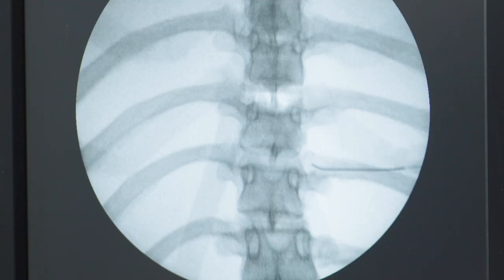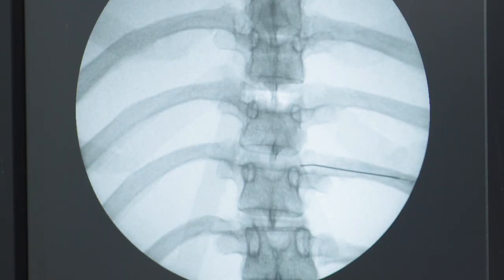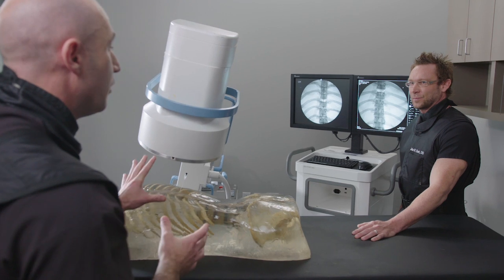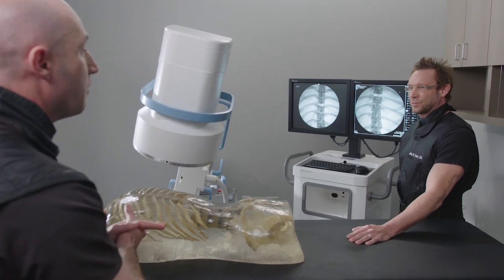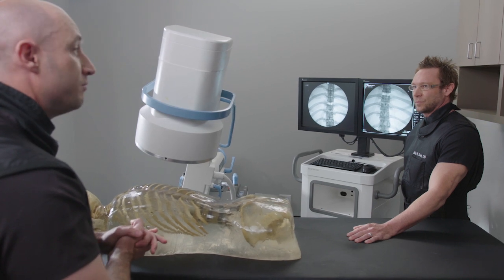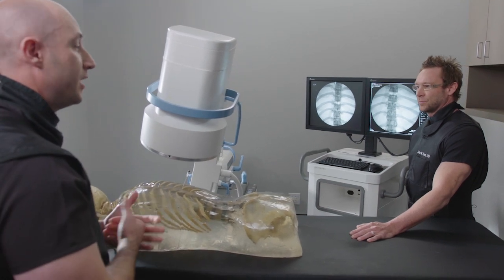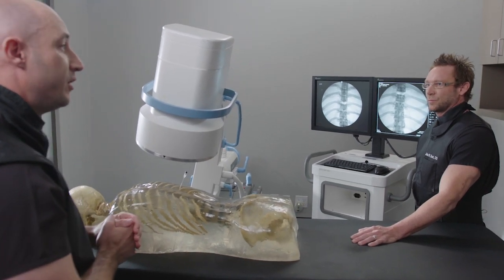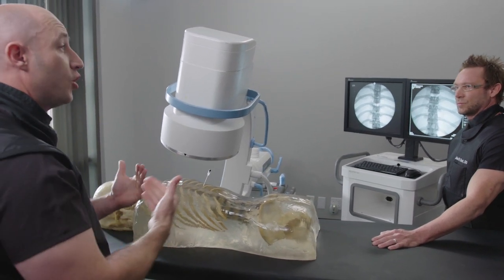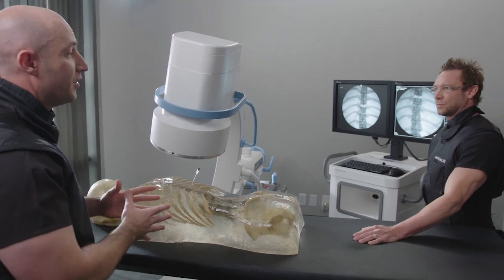take another picture. So I simply push the needle a little bit deeper, and sure enough, I'm right there just above the pedicle at the retrodiscal transforaminal space. So at this point, my needle looks in great position. I'm very safe. I'm above the rib. I'm at the pedicle. I could take a lateral view to confirm my depth, make sure I'm not too deep. I could do another oblique view to see where I ended up. There's any number of things I could do to learn depending on how comfortable I am with this procedure.